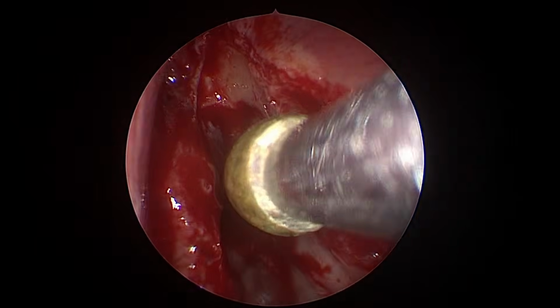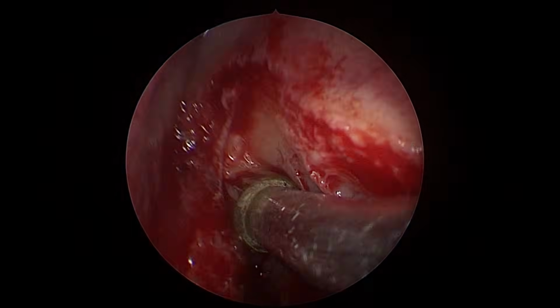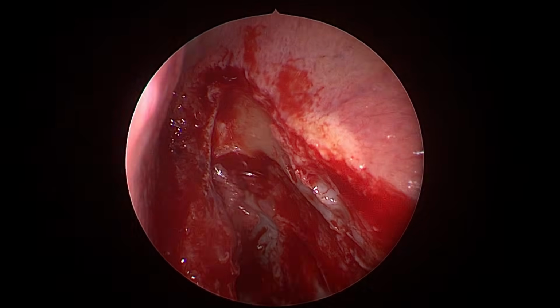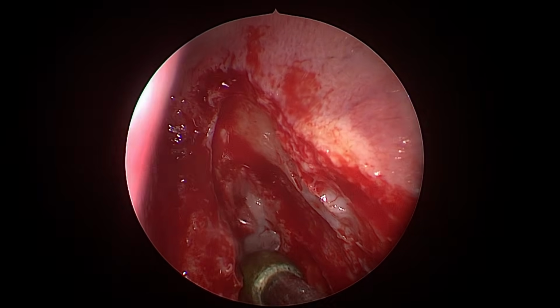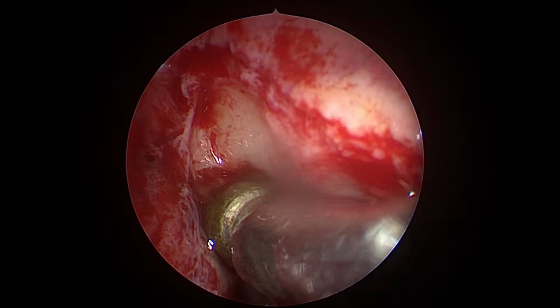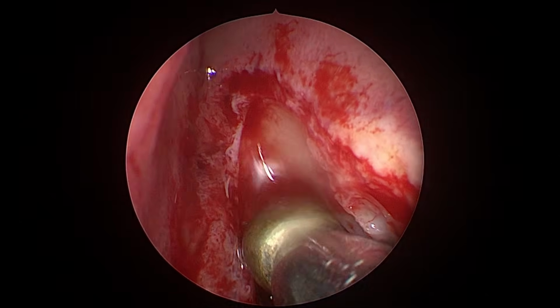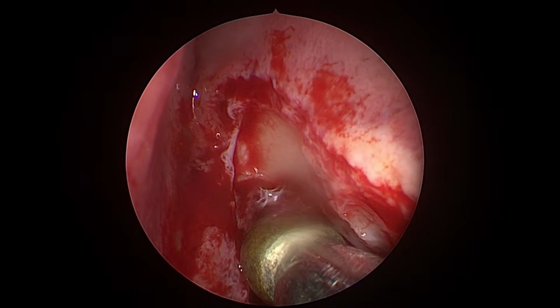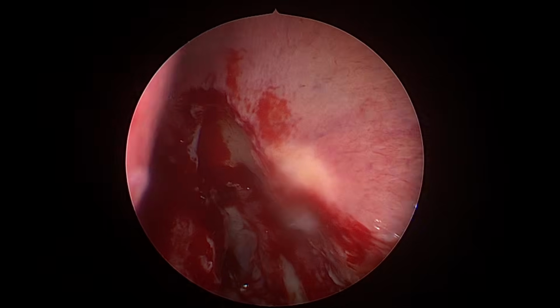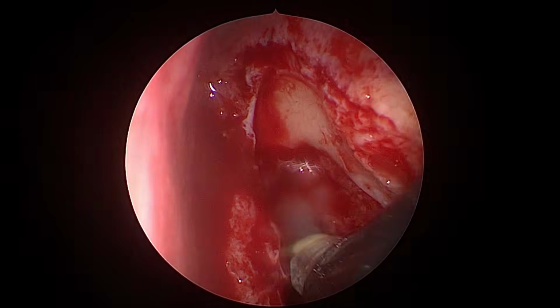Mandal, can you see the beak? Yes, sir. The thickest bone in this region. My concerns in frontal sinus surgeries are multi-pronged. I have a fear of orbital injury, a fear of skull base injury, a fear of arterial injury. So many fears, because the frontal is situated in such a region that in close proximity are several tigers. How can you avoid them? 70 degrees is the key.